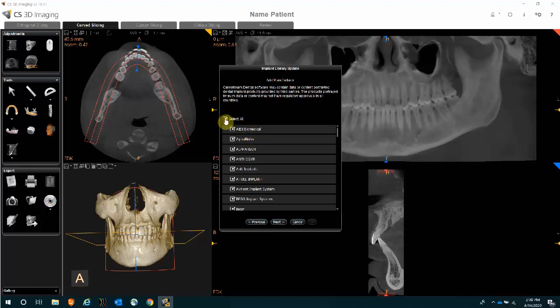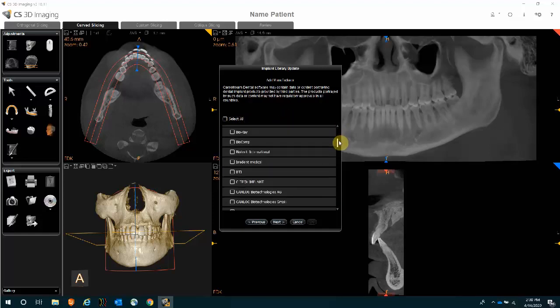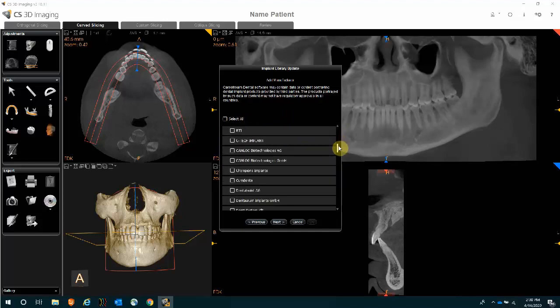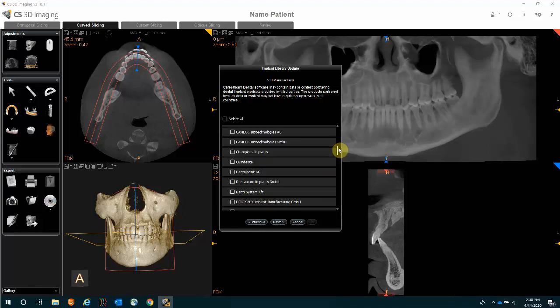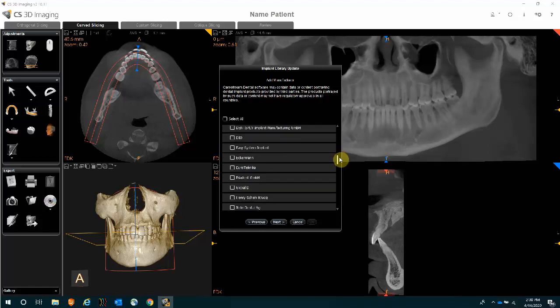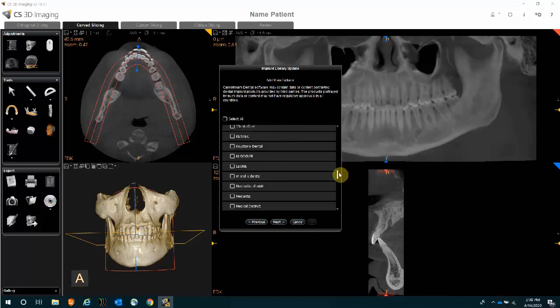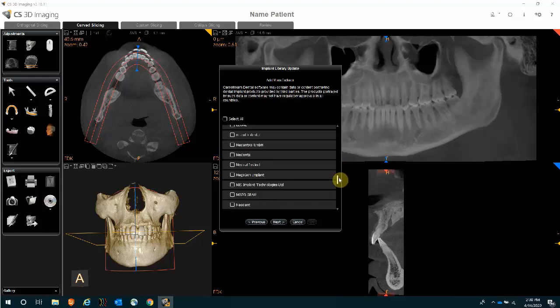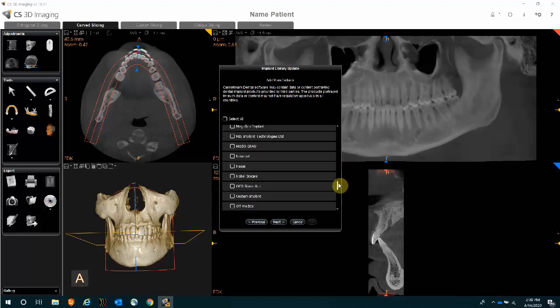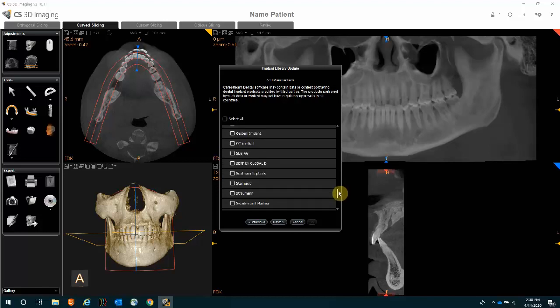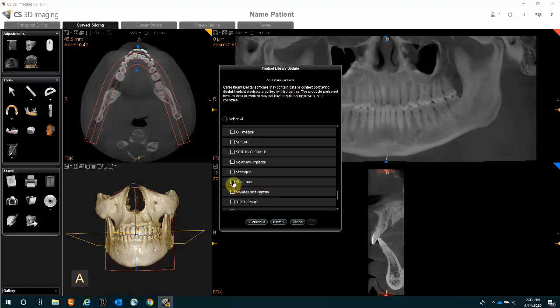The advice is to go ahead and select the option that says 'Select All' to uncheck all, and then simply look through the list. It is alphabetically aligned. Find the implant manufacturer you are looking to install. You can select multiple brands. Select the implant manufacturer of your choice and click Next.